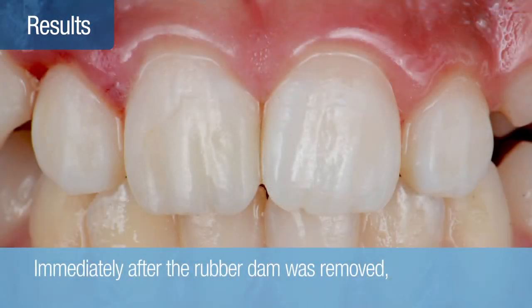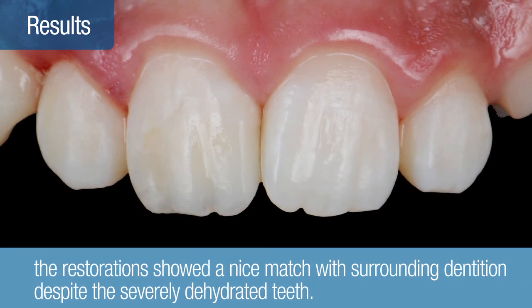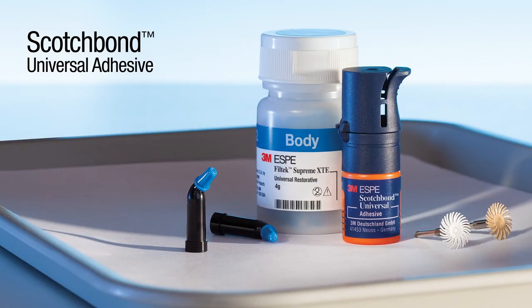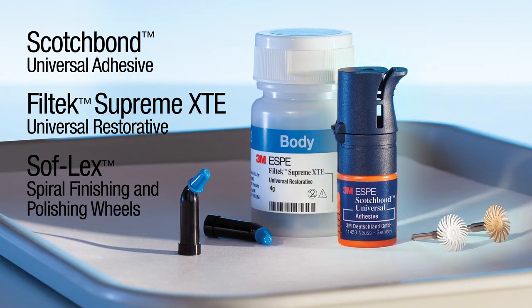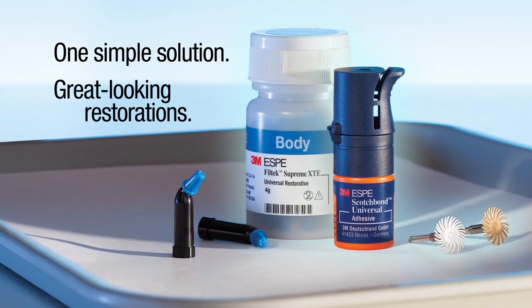Immediately after the rubber dam was removed, the restorations showed a nice match with the surrounding dentition, despite the severely dehydrated teeth. One week later, when the natural teeth had become rehydrated, the restoration showed a beautiful match that was virtually undetectable, mimicking the natural translucency of the adjacent teeth with only two shades. The optimum outcome was achieved with maximum simplicity. The restorative procedure solution combines proven products together as one simple solution to help you achieve great-looking restorations for the long term.